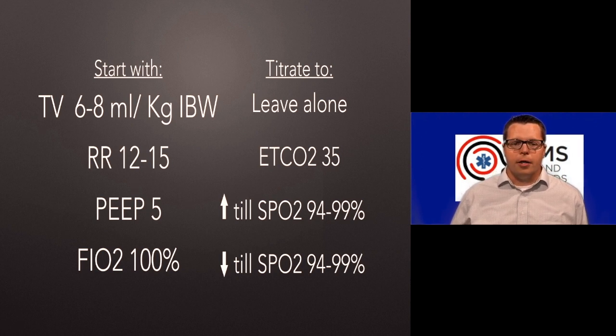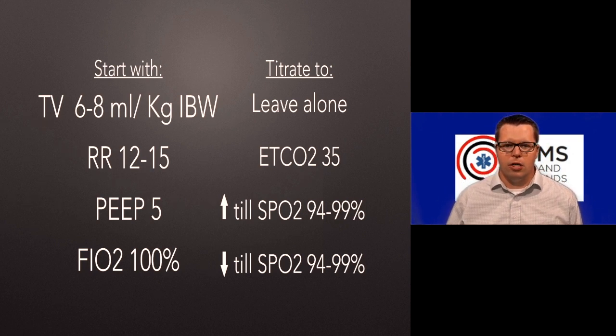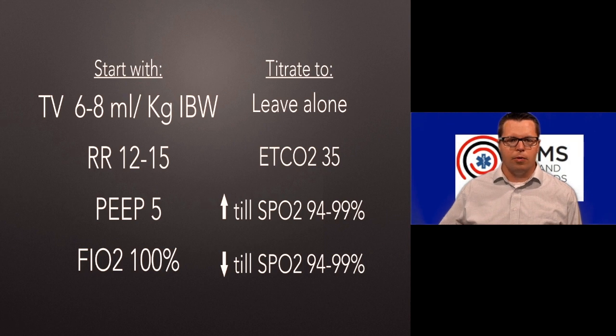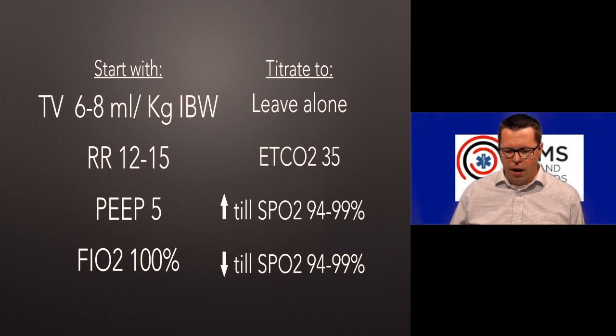All right, I talked before about all the different parameters that you may need to do effective and safe ventilation and oxygenation for your patient. We talked about tidal volume, rate, PEEP, FiO2, and how you change all those things and what those things change for the patient. It's important to know that all this stuff is still super important for the non-ventilator dependent patient.